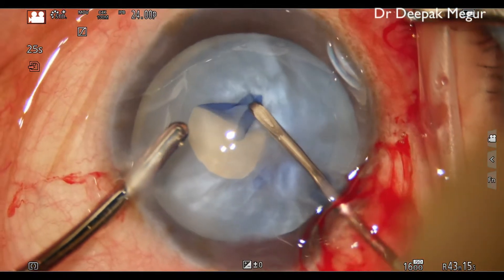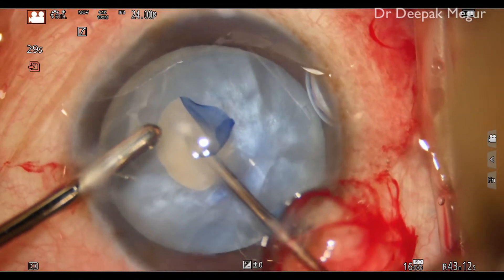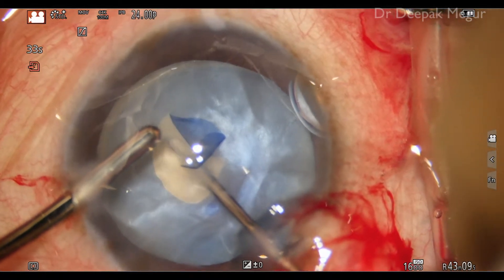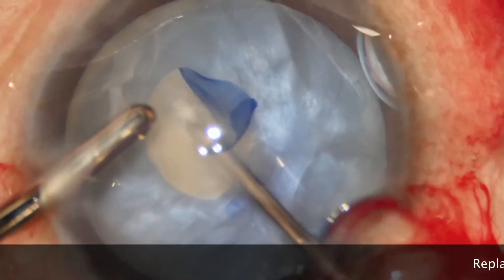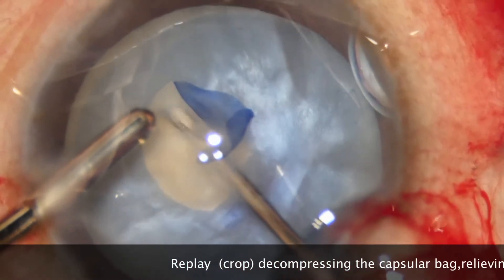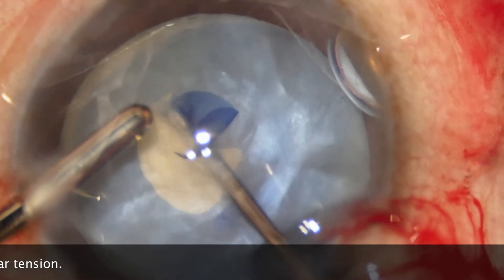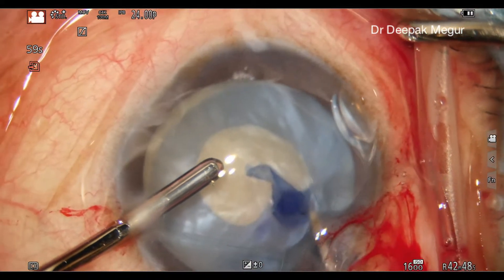In my technique, I use a cystitome attached to the bimanual irrigation aspiration system. The cystitome is introduced under the anterior capsule to aspirate the subcapsular cortex. This relieves the intralenticular pressure. You can see the needle is under the anterior capsule and aspirates the subcapsular cortex.